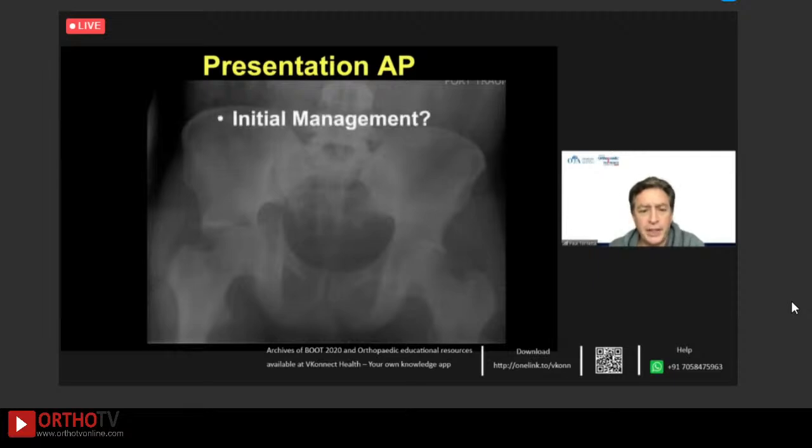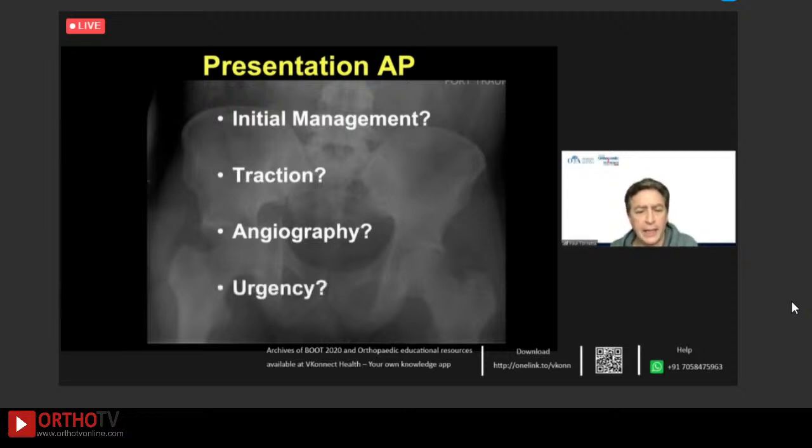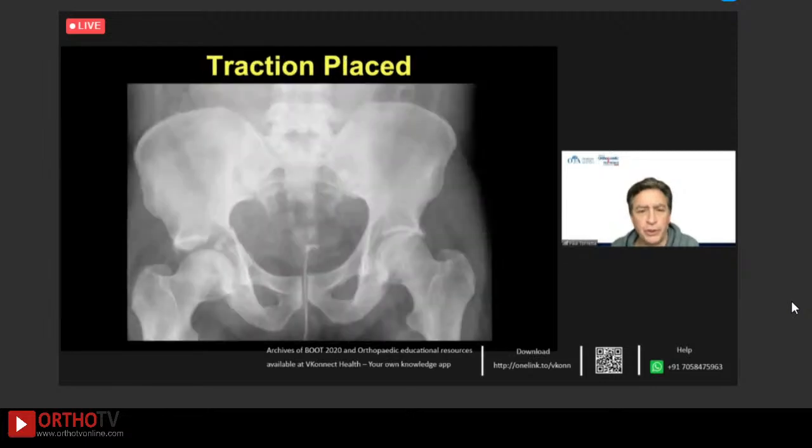So initially we put it in traction. I think that's a good idea. I'm not sure if anybody else uses angiography. If someone has a problem that goes into the notch, we get a CTA when they go through, but this one didn't get it, and I don't think there's any real urgency to it. So we put a traction pin. The SI joint still looks a little bit wide. Sometimes these will look really pretty good once the hip is reduced.